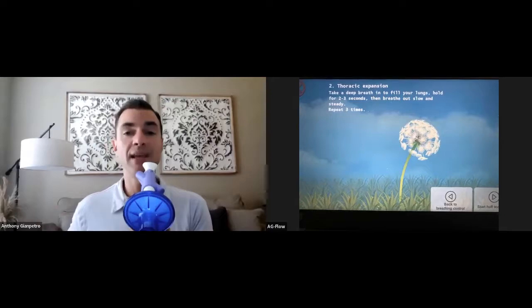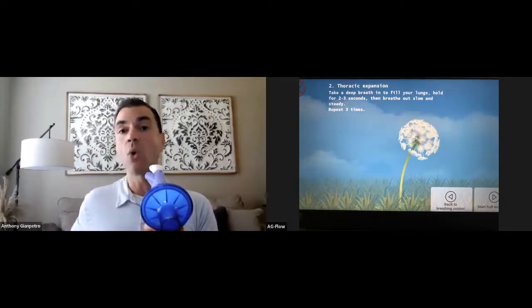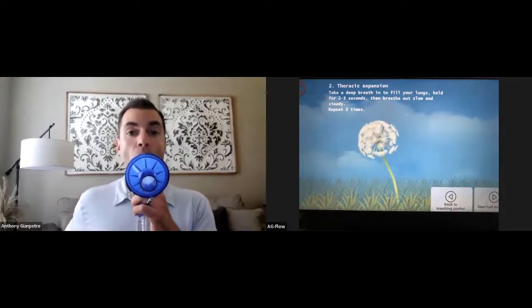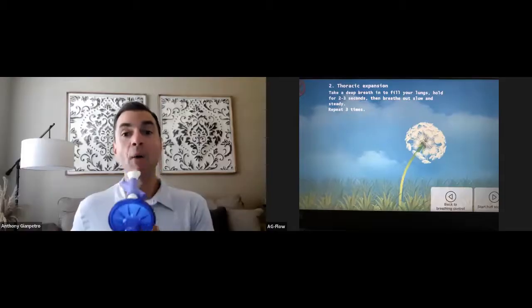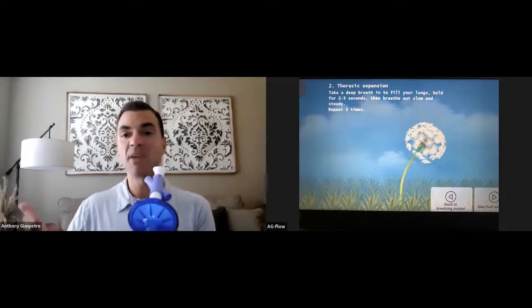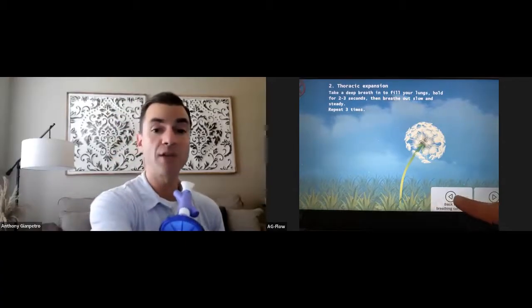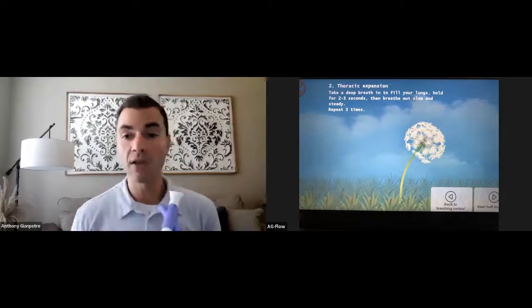Okay, so how does this work? I'm going to take a breath in, and just like before, I might put my hands on the patient's rib cage or have them place their free hand there and just see if they can belly breathe with that. So it would look like so. Now I chose to do a 2 to 3 second inhale there. You don't have to do that, but same thing. Maybe try 1 rep of that, maybe try 2 or 3. It's all what you and your patient feel is needed. You can even go back if you wanted to the diaphragmatic breath, if you feel your patient needs that, or you can move right into the huff technique.